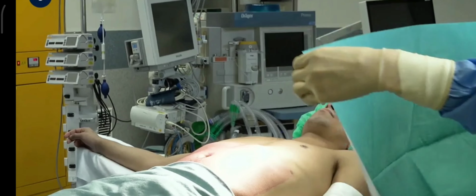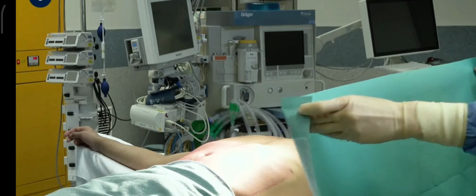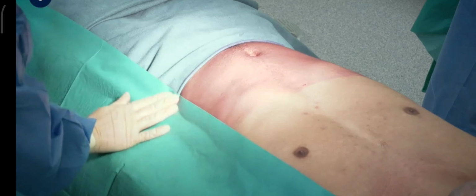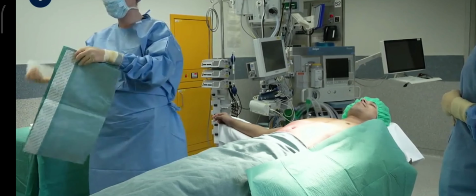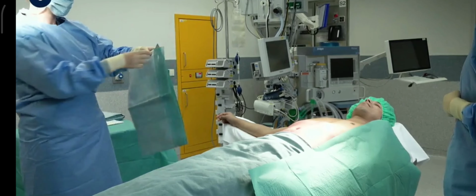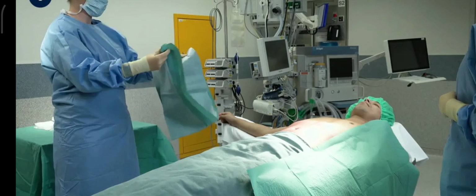Once unfolded, it is applied to the patient's side. Take note of how the surgeon maintains a fold at the edge of the drape to avoid touching the patient. The scrub nurse then does the same on the opposite side. Unfolding is performed in a manner that avoids contamination.